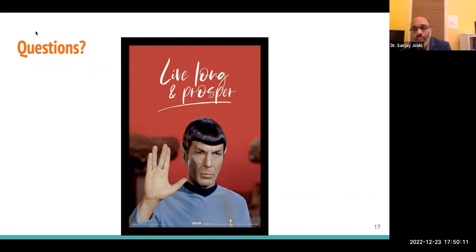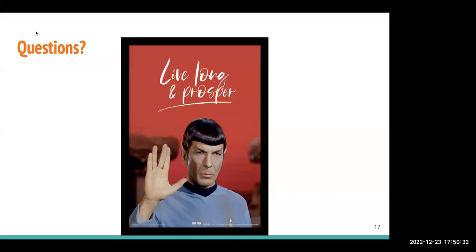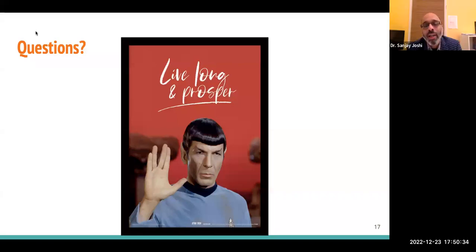I assume you have done it already, but for any wireless power transfer to the device, my gut feel is you are going to look at the 60601 family of standards. I don't know exactly which one will apply, but those standards should apply. Now, if you are going to do inductive wireless energy, also think about heating, because usually the power transfer will cause heat, and that heat is going to be inside the body.